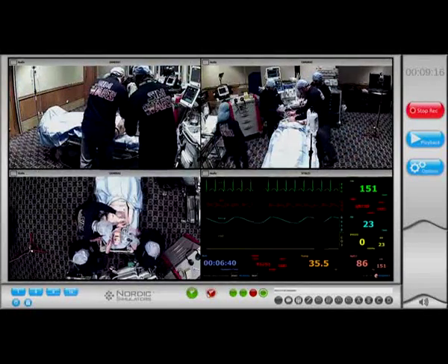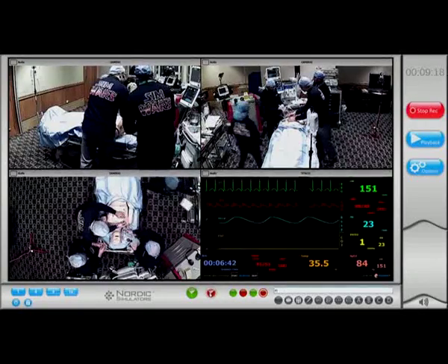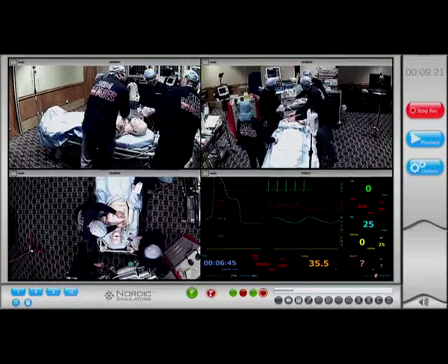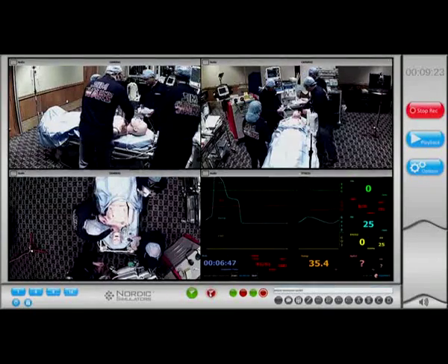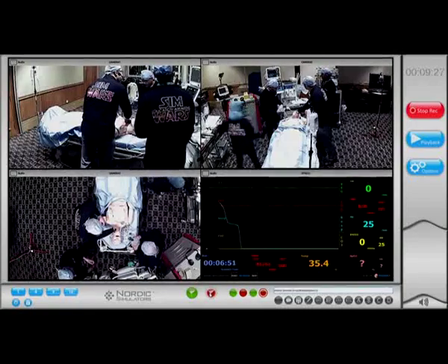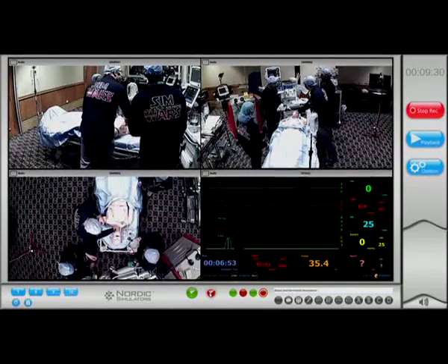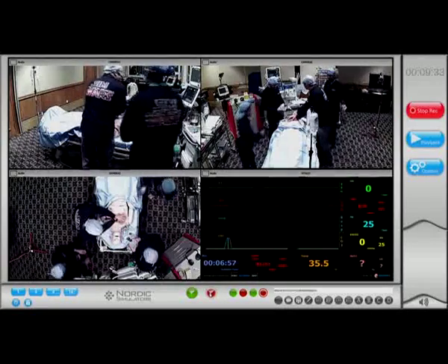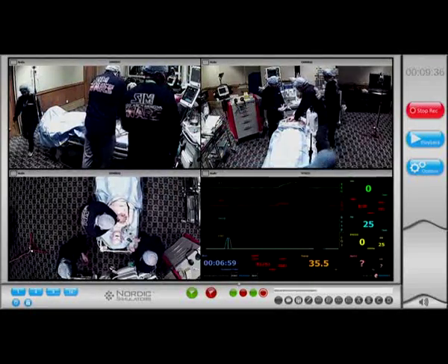Okay. Now he's breathing again. Insert it. Now we'll check the pulse. It's transformed to asystole. Okay, we have an asystole. Do you want to do CPR? Chest compression. Okay, no pulse. Please start CPR. Okay, we'll start 100 to 110.